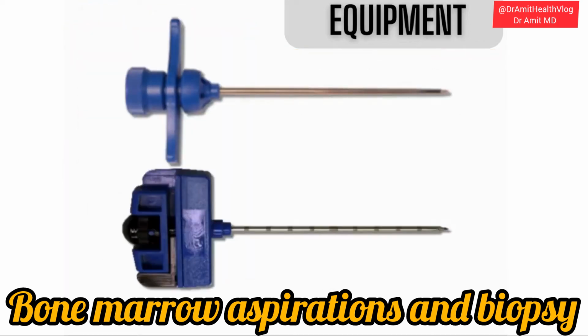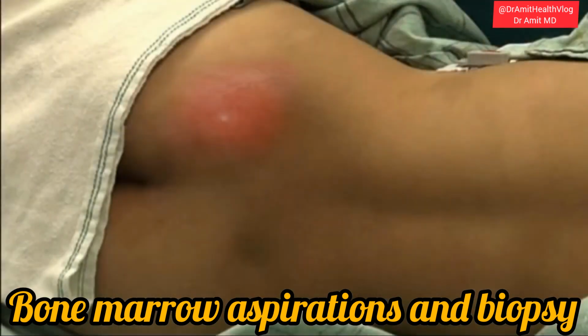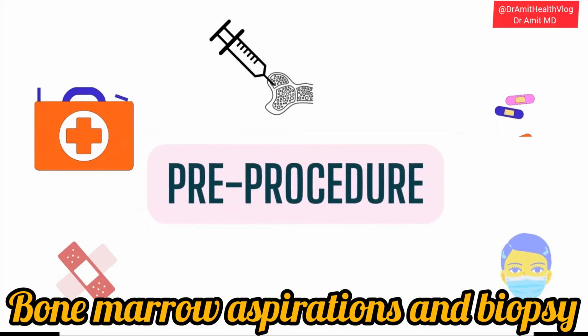Several types of bone marrow biopsy needles are commercially available. This video will demonstrate the use of the Jamshidi needle for obtaining a core biopsy. Bone marrow aspiration and biopsy should not be performed if an infection of the bone is suspected.